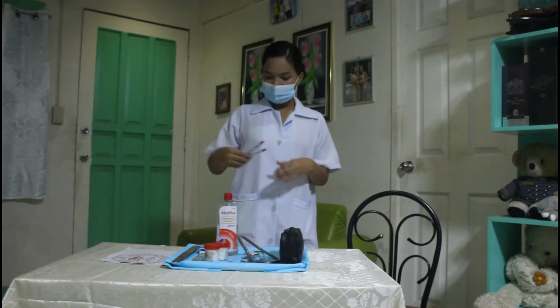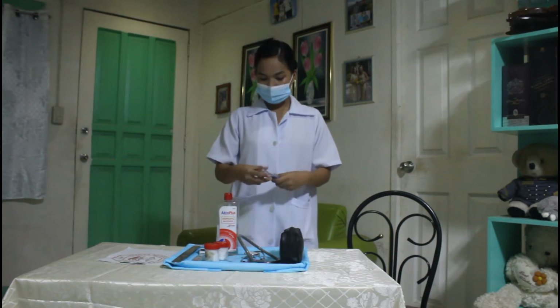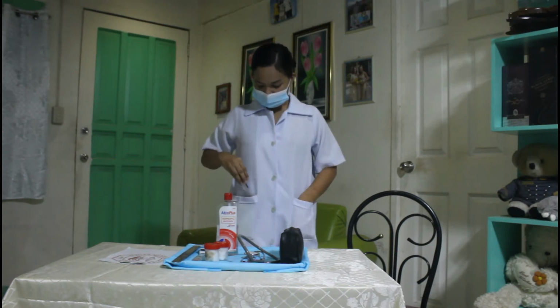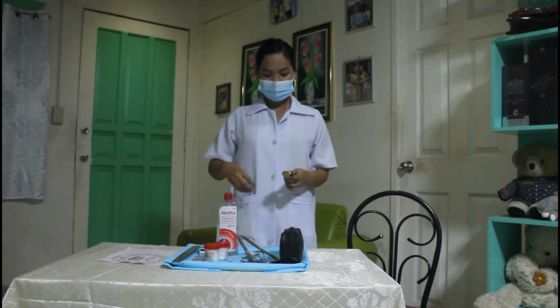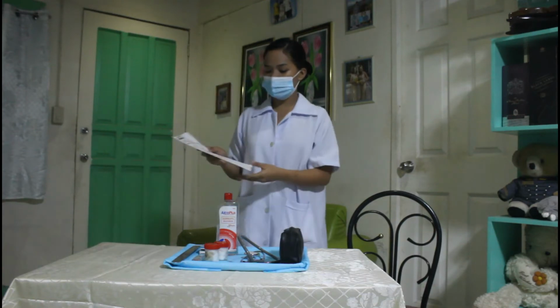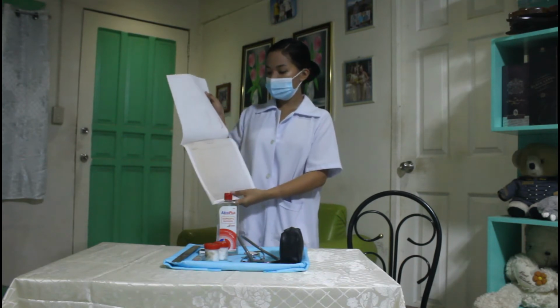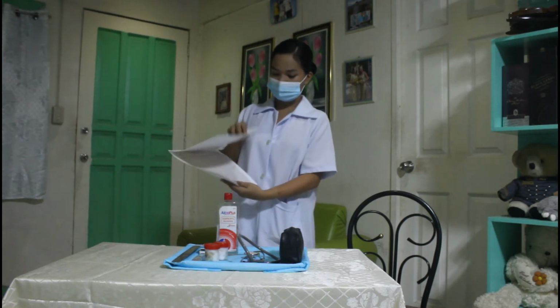Then my ball pens, which are the black, red, and the blue one. And also I have here a watch with a second hand. And also here is the patient chart with the TPR monitoring sheet in it.